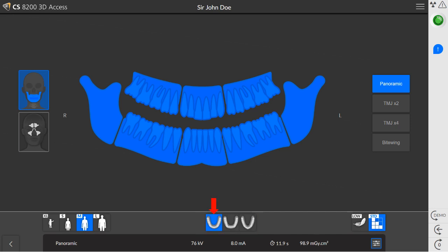U is for a normal jaw shape, and square or V are for a narrow arch shape. Select from the following imaging modes: standard mode, which is designed for all 2D acquisition; and low dose, which reduces a patient's exposure to radiation and is used only for panoramic acquisitions.